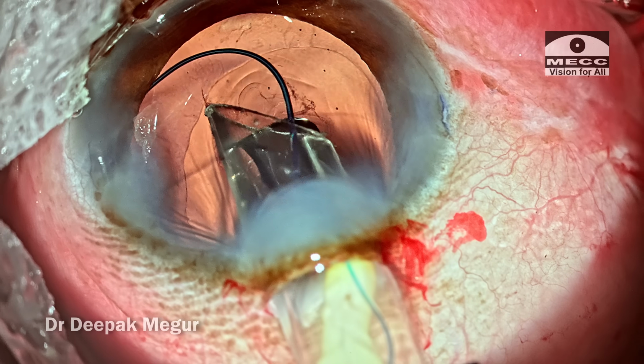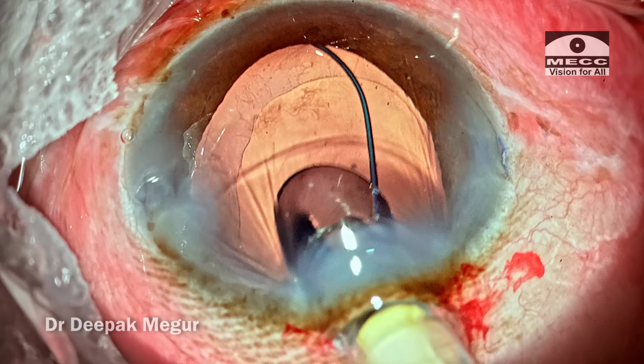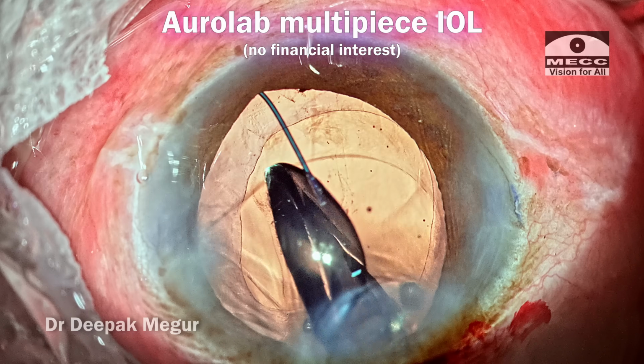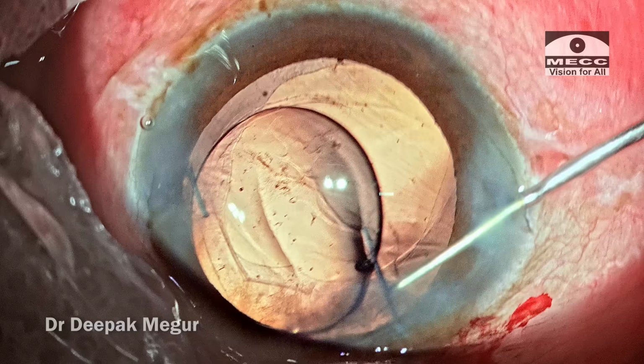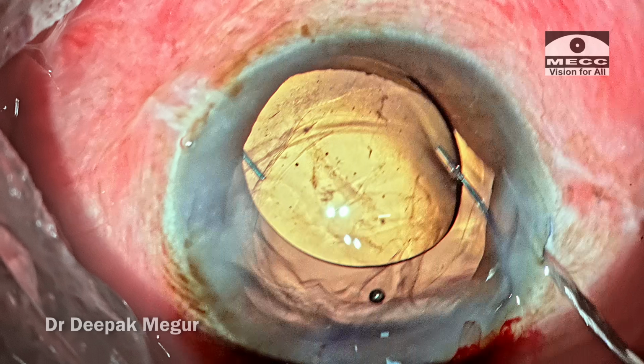Okay, time to implant the lens. In this case, I'm using a new lens which I am not very well accustomed to. This is the Aurolab multi-piece hydrophobic lens. So as I'm implanting the lens, the haptic goes in all right, but the lens flips. So now it is in an orientation which is the other way around. It's flipped. So how do we straighten it?